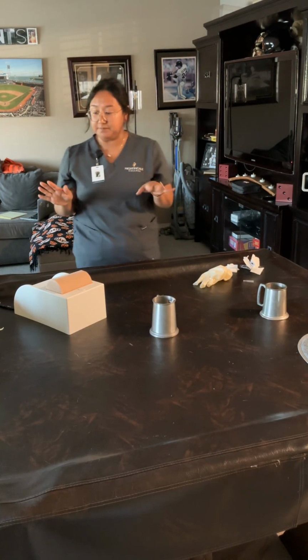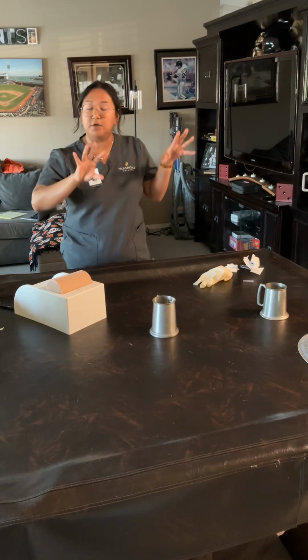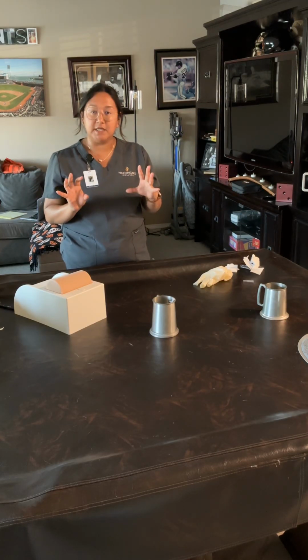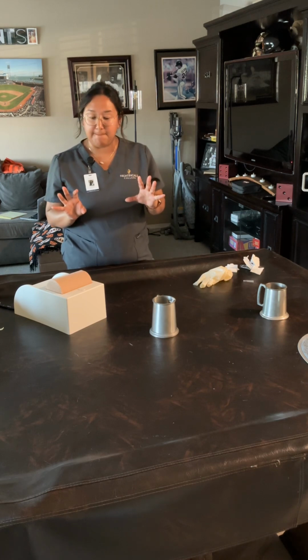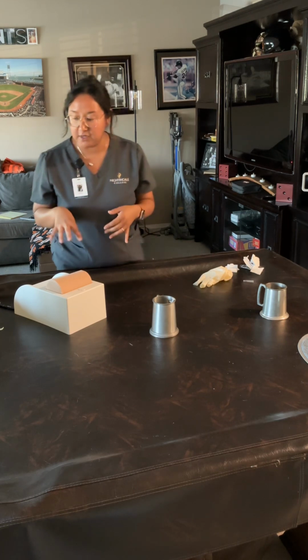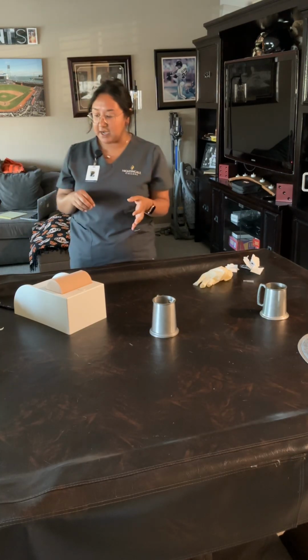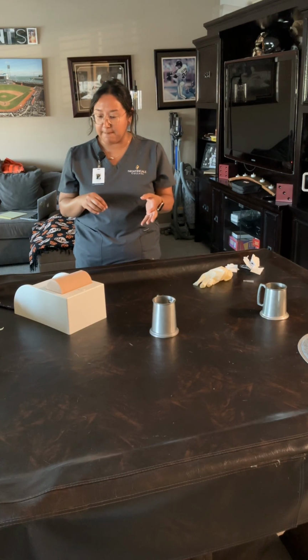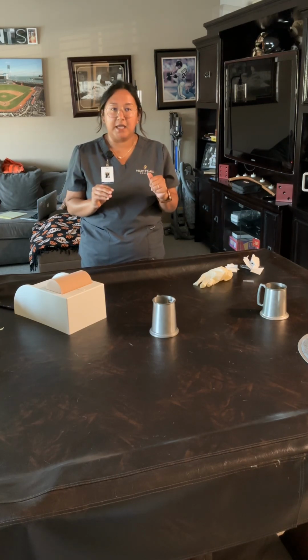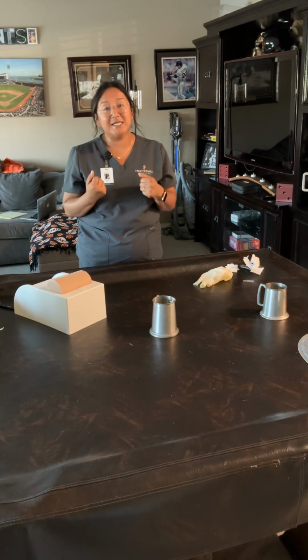I'll double check my patient's good. I'll give them a call light, let them know if there's anything I can do for them while I'm there. I'll document in the EHR the right route, the right site, the right medication I gave, and the dose and time. And I'll double check that they're good and okay, and ask them if they have any questions. I'll thank my patient, and then I will exit. Thank you.